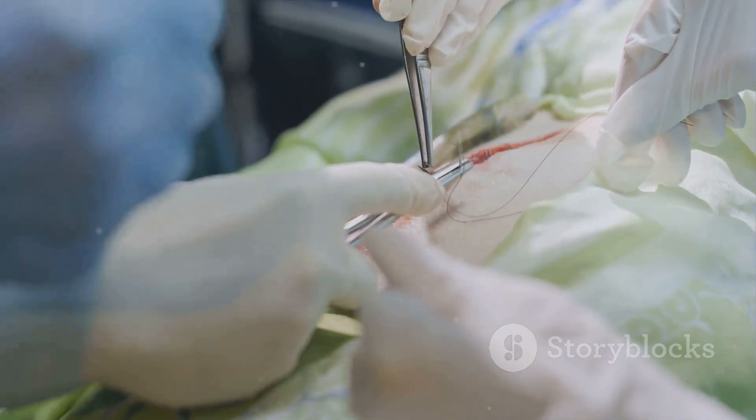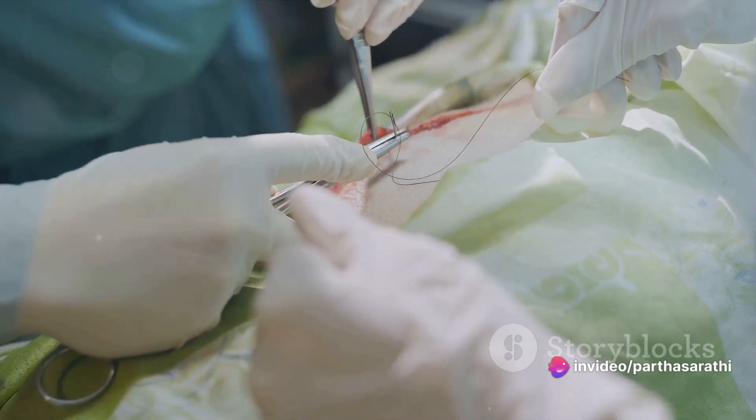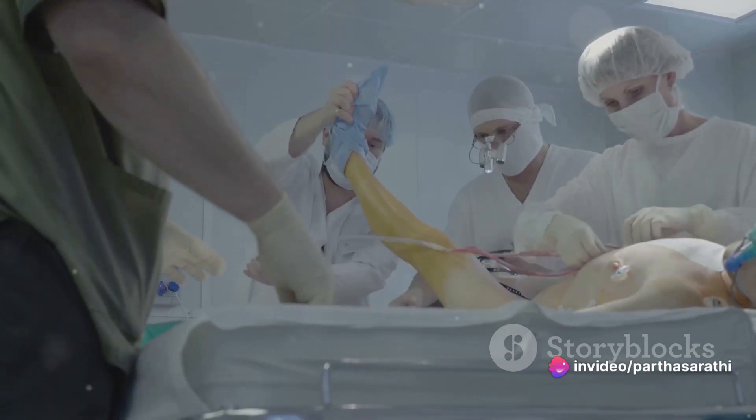Once the tubal occlusion is successfully done, the surgeon meticulously closes the incision site using sutures or surgical adhesive.